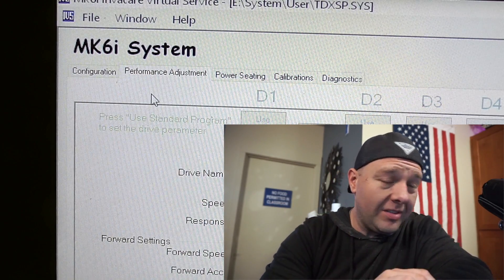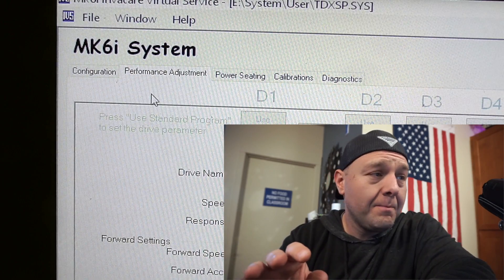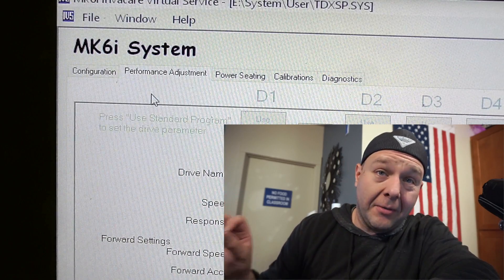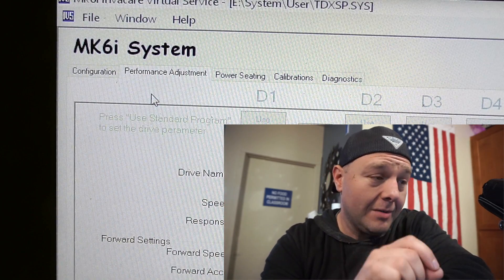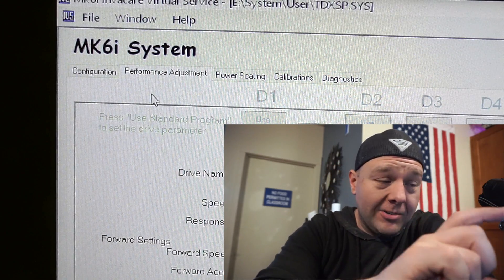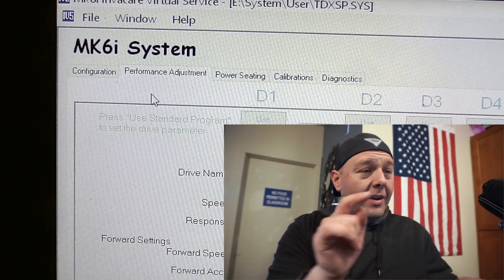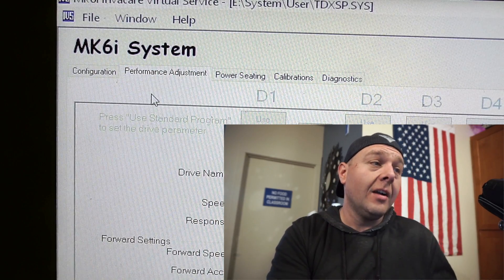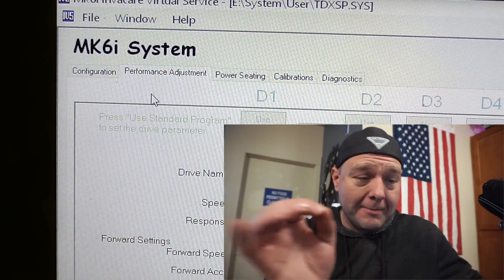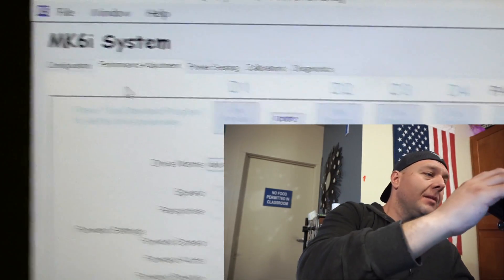The problem with programming with these SD cards is that anytime you change file names or copy the file off to another spot and put it back, these controllers get really picky. So you want to be extra careful when making changes — write down everything you've changed, maybe take a picture of the settings with your phone before you change it, that way you can put it back to how it was. There is a way in the software to go back to the default settings for that chair, but if you try to do a save-as with a different file name to back it up, you're going to run into problems.